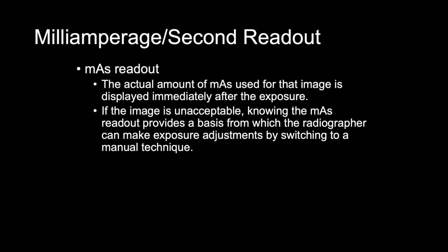Knowledge of the mAs readout has a number of advantages. It allows us to become more familiar with manual exposure technique factors. If the image is unacceptable, knowing that mAs readout provides a basis from which we can make exposure adjustments by switching to a manual technique.